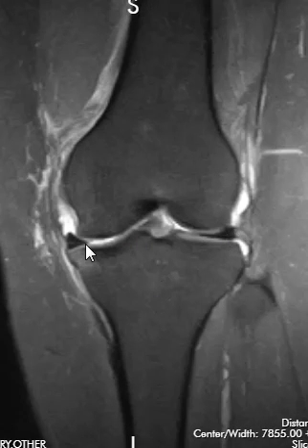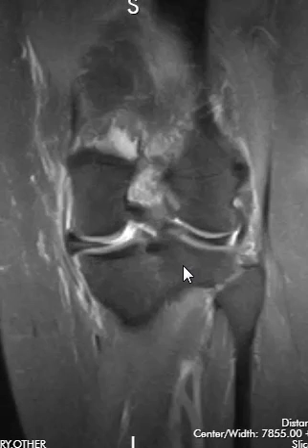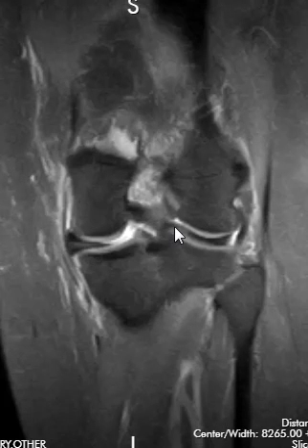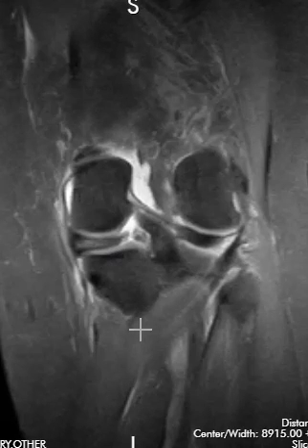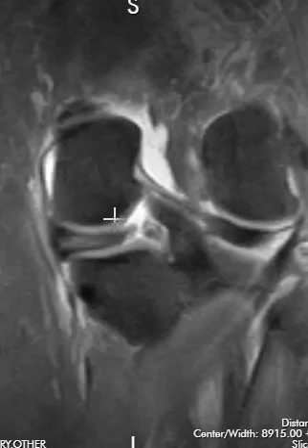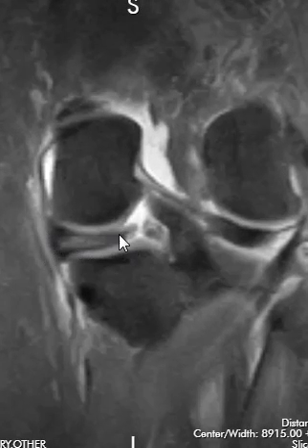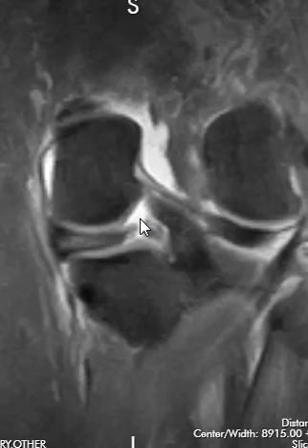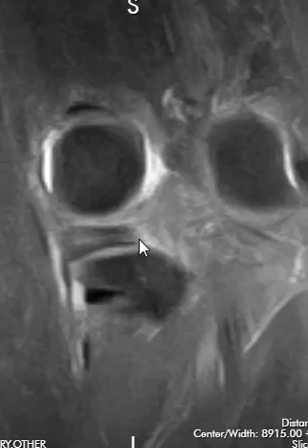If we go towards the front, the meniscus here looks good. If we go towards the back, we're going to keep going backwards — the lateral meniscus looks good in the back, and the medial meniscus here has a tear right here. There's a vertical tear, and you can see fluid going right vertically through that tear, and you can see how this meniscus is drifting outwards. It's not held tight anymore. This is called a radial tear of the posterior horn — the back of this — and this is called the root where it attaches to bone. So posterior horn near the meniscus root.